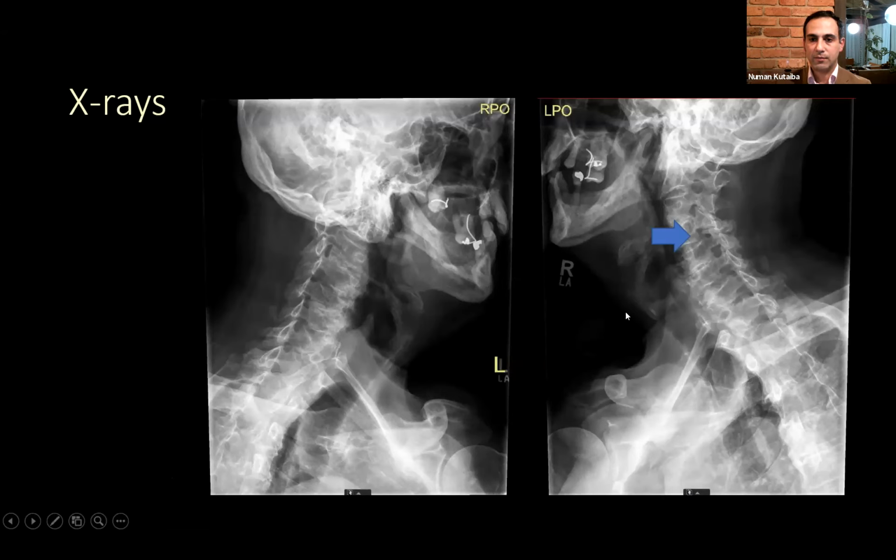Foraminal changes are best seen on these oblique views. As you can see, these are the foramina at multiple levels. The arrow indicates an area where the foramen is narrowed and there's facet joint arthropathy at that level. If you compare it to the level below, the foramen is open and capacious. So this foraminal narrowing is the site where a nerve root is exiting at that level and is likely to be impinged in this location. That's from the bone point of view.